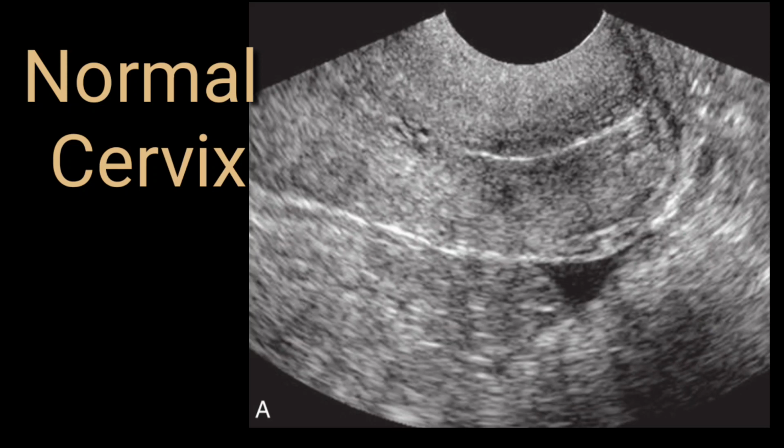So far as the cervical scanning is concerned, it is obvious that you can see and appreciate any pathology related to the cervical canal, the cervix itself. So far as cervical erosions are concerned, erosion cannot be picked up on sonography until there is any gross pathology, or any abscesses, or any cystic formation. So you can pick that up on ultrasonography, but not the laceration. So this is the normal cervix on the transvaginal scan.